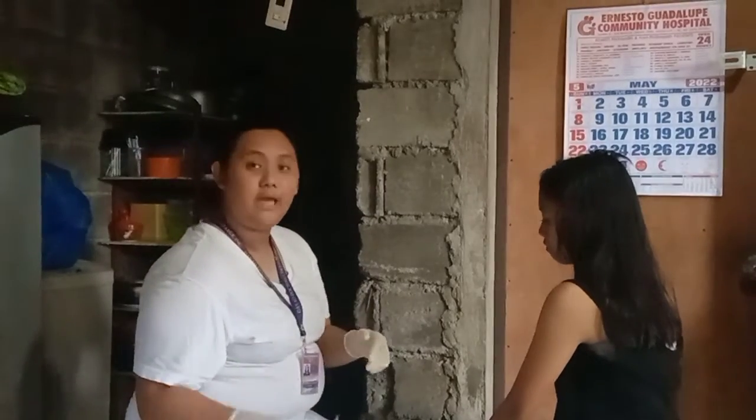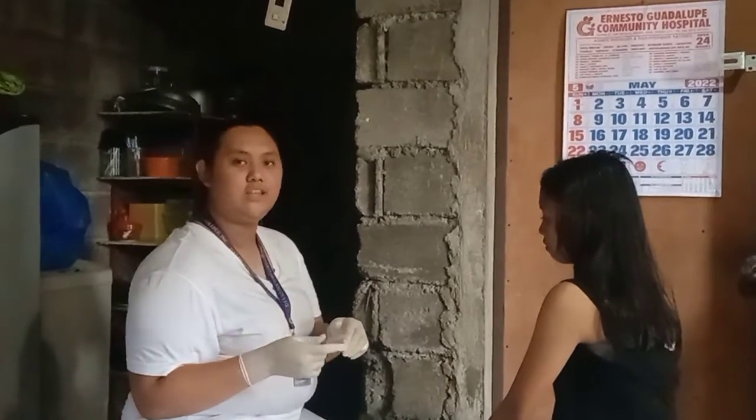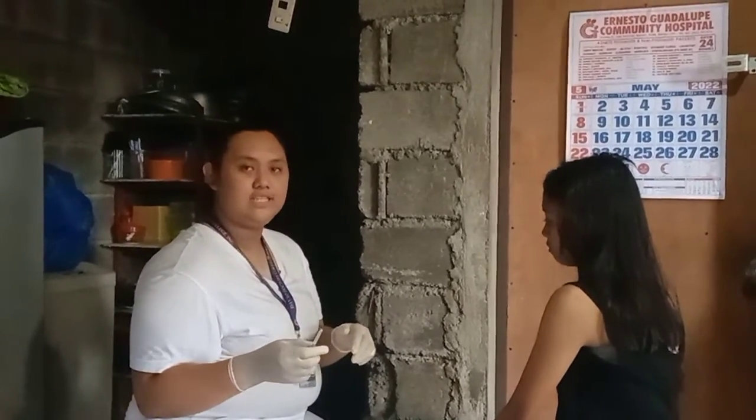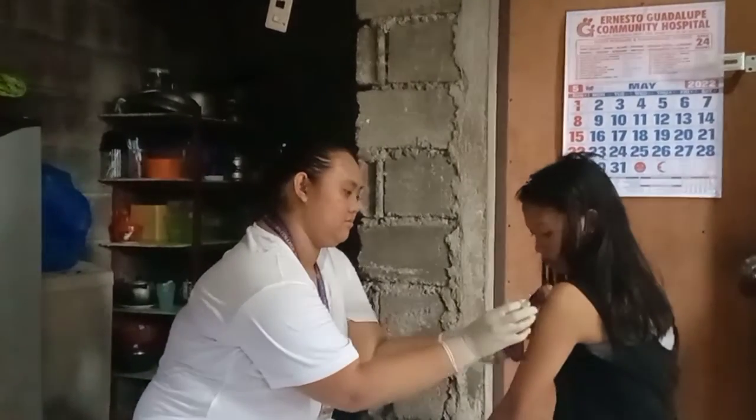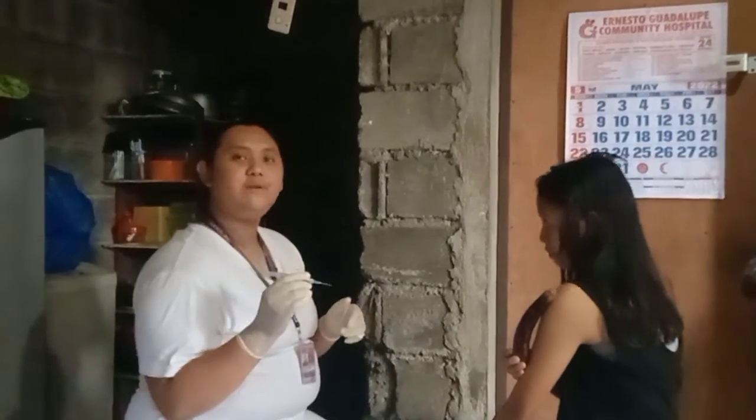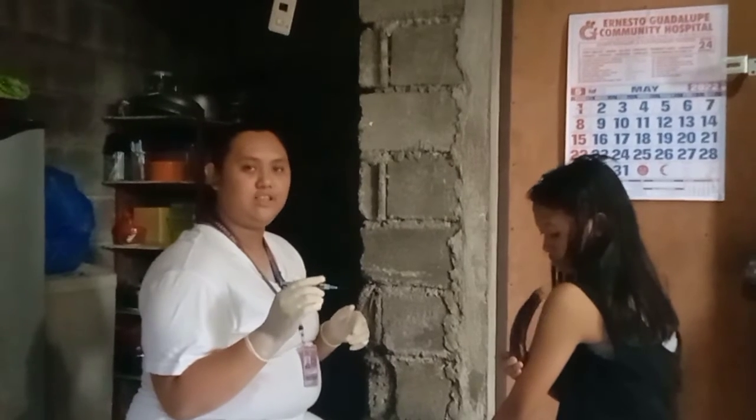Remove the needle cap by pulling it straight off. Hold the syringe with the thumb and the forefinger of your dominant hand as you would hold a dart. This prevents the needle from touching the side of the cap and prevents contamination.